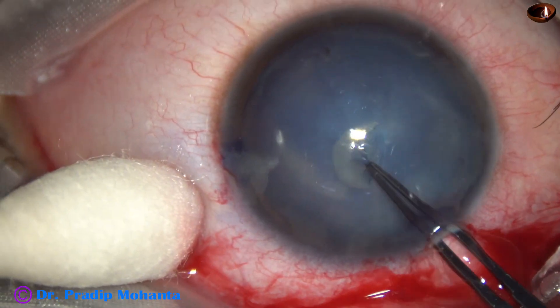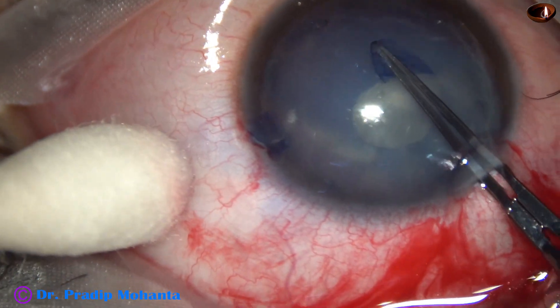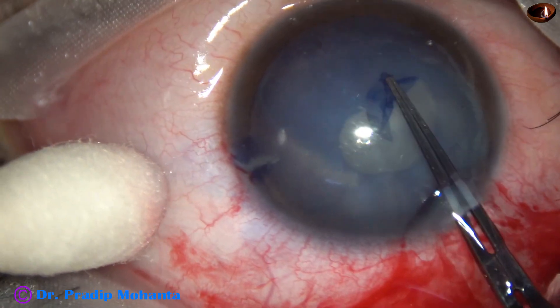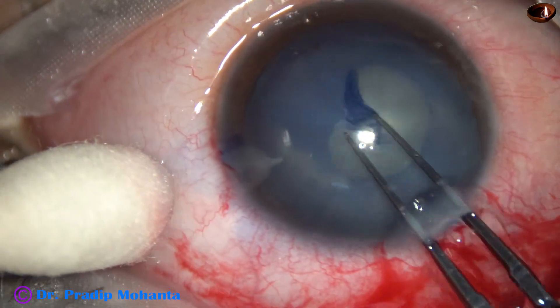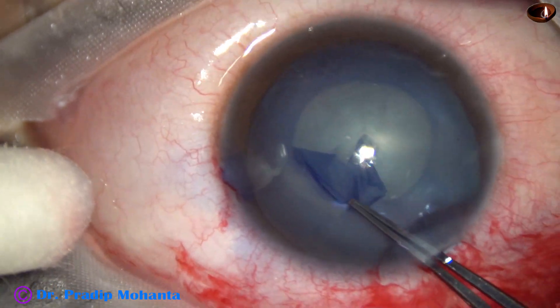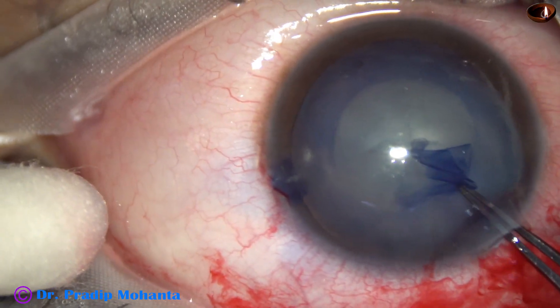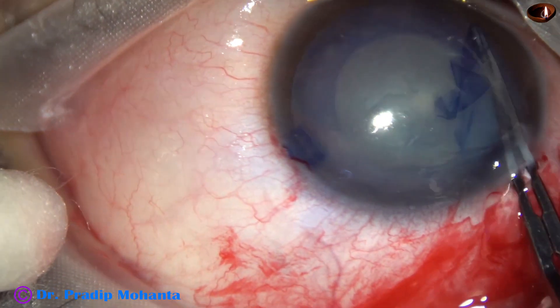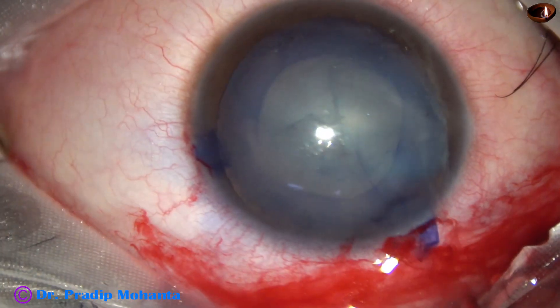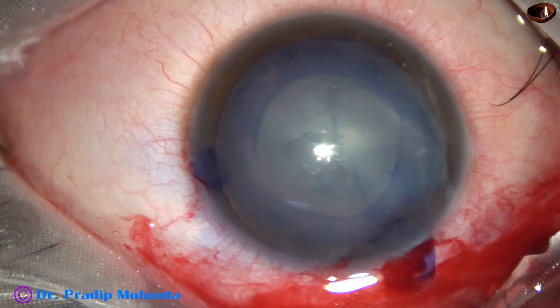In this case, I had to struggle a bit for the rhexis. However, with the help of the utrata forceps, I am able to do the rhexis. Little jerky pulls give me better control to do rhexis in such cases. The size of this rhexis is about 5.5 millimeters and it is adequate.